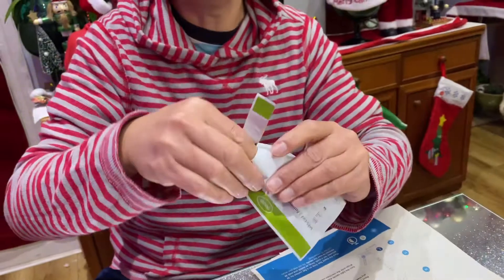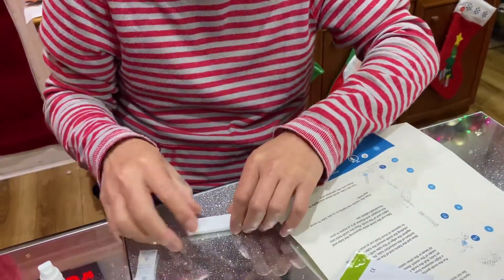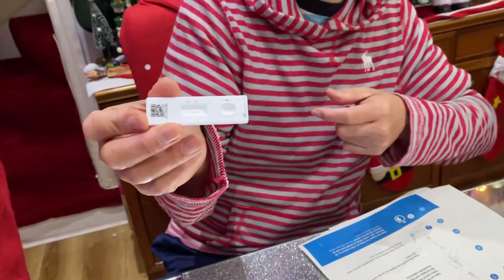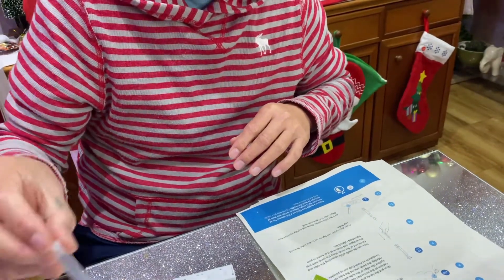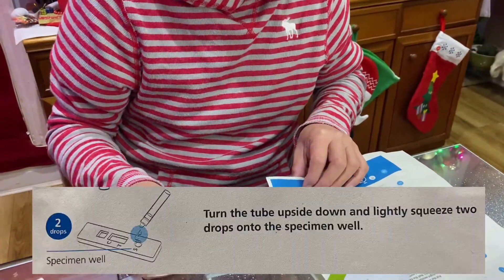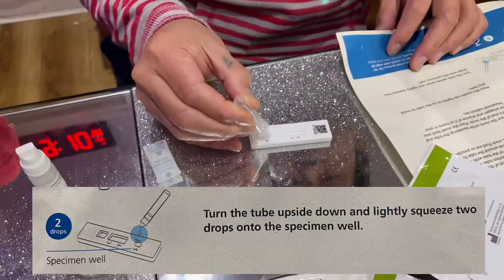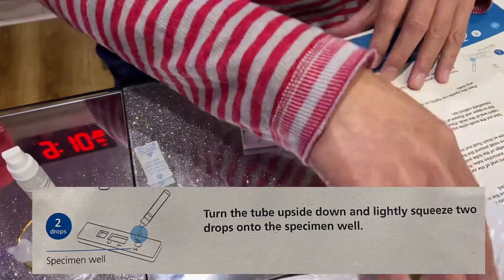Remove the cartridge and take off the lid. This is the tester — it's like a pregnancy test. Take off the lid and drop two drops into the specimen well: one and two. That's it.